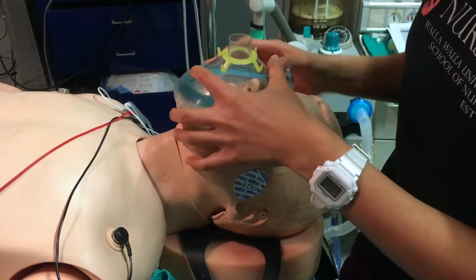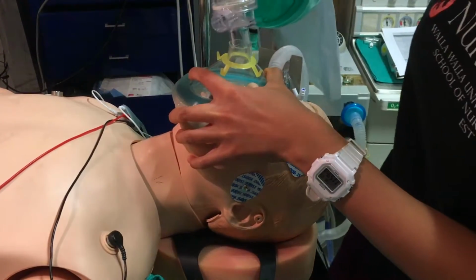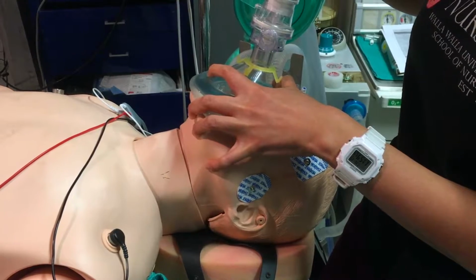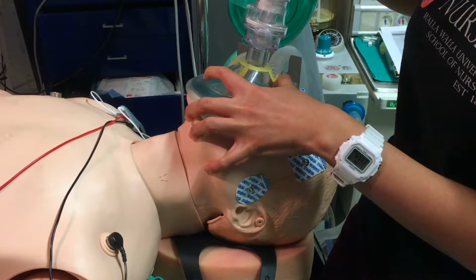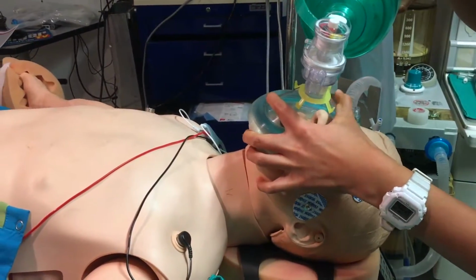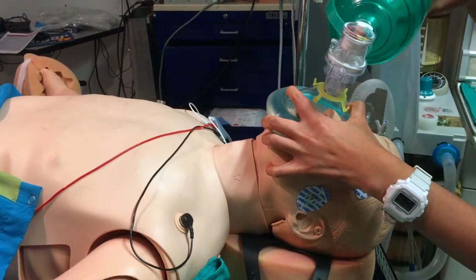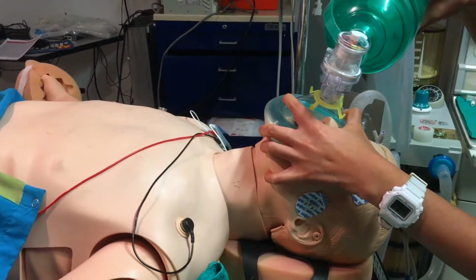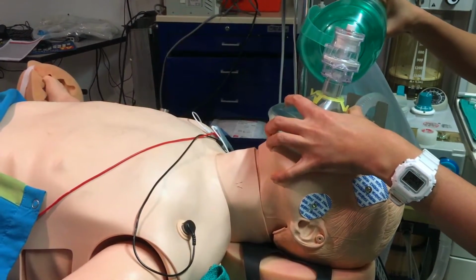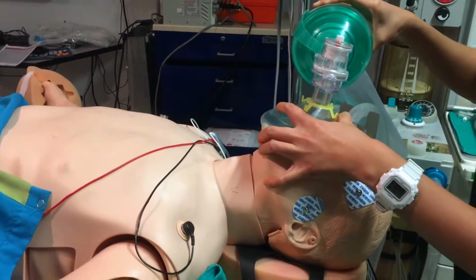And then of course, if you have an appropriate seal, you can assess if you're masking well by checking for chest rise and hearing if there's a leak. If there's a leak, the C part of the EC clamp position, you should always go towards where the leak is. So if, for example, there's a leak that I hear and it's on the right side of the mask, I want to lean it towards the right side and then be able to mask the patient. And that's how you properly mask somebody.